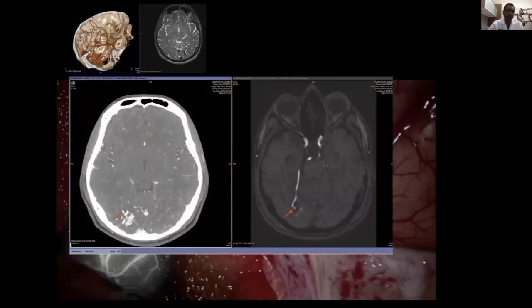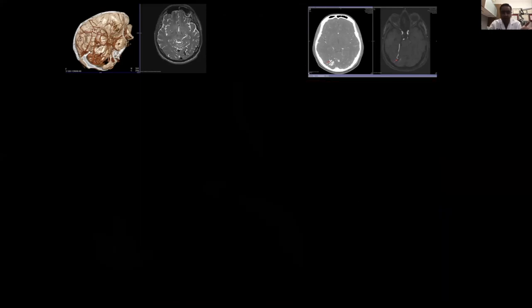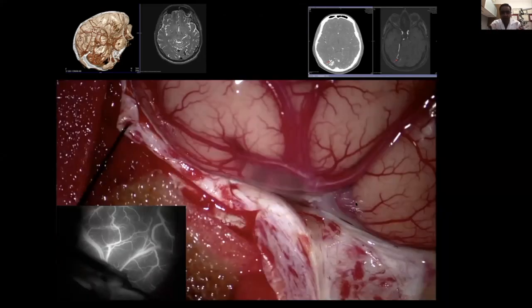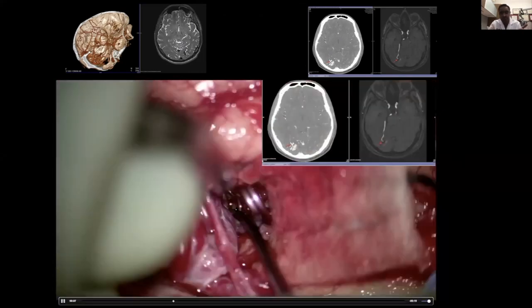Here's a very clear example of how you would do this small and then extrapolate that to big. This is a very smart medical student here who came to us and wanted an opinion about this Spetzler-Martin grade 2 arteriovenous malformation in the occipital cortex. He needs his vision to do a good job in his life. And, you know, the concept is you do the arachnoid dissection. I don't think anybody would say, don't take that feeder first. Of course you would. That's how you take this down. It just happens to be the bottom feeder.